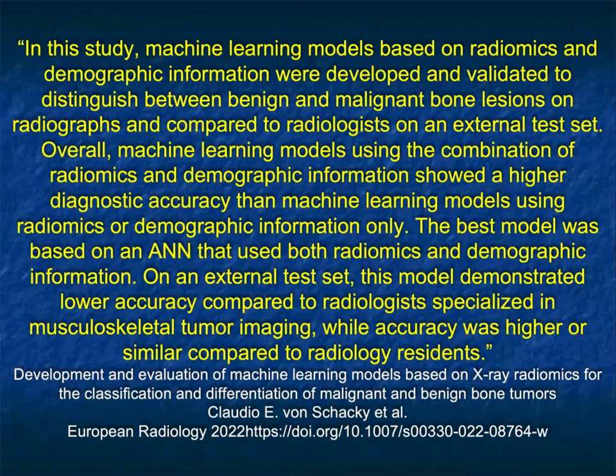Here's an article looking at X-ray radiomics for the classification and differentiation of malignant and benign bone tumors. So now we've been looking at fractures, we've been looking at management of those fractures, and now we're looking at bony tumors. Again, can machine learning help us, using radiomics, determine whether a lesion is benign or malignant?